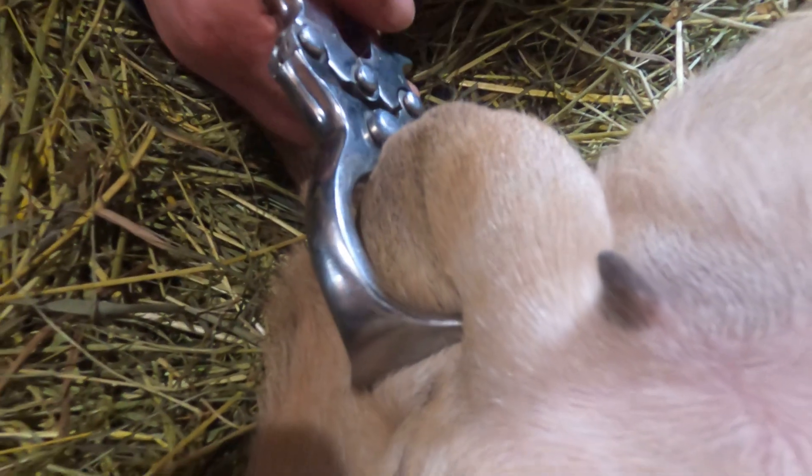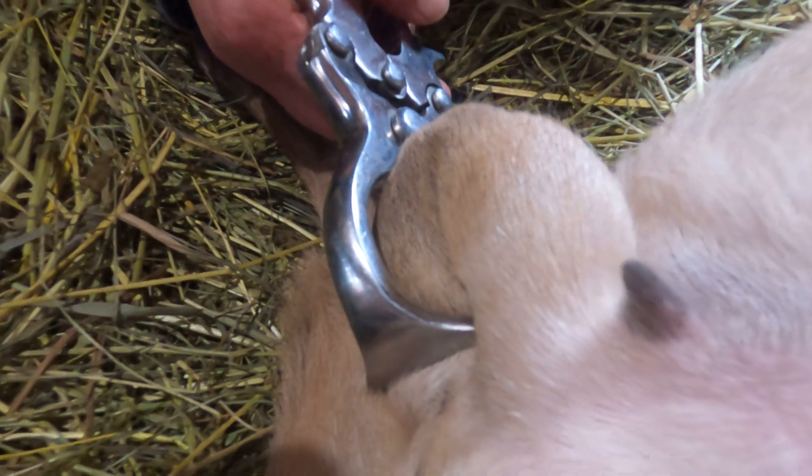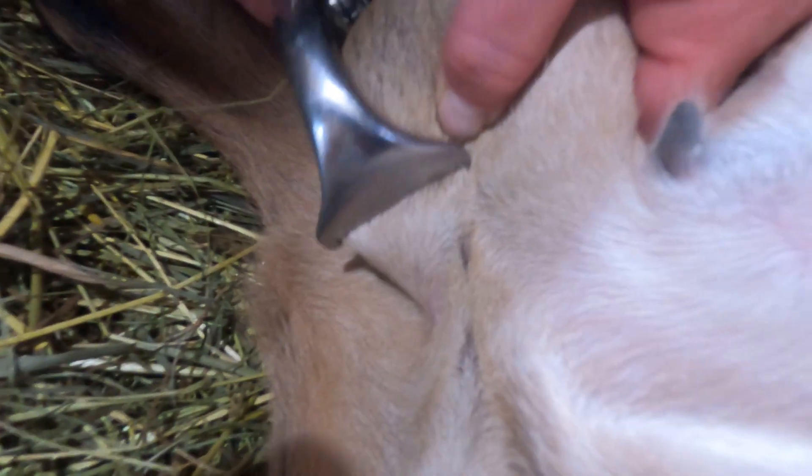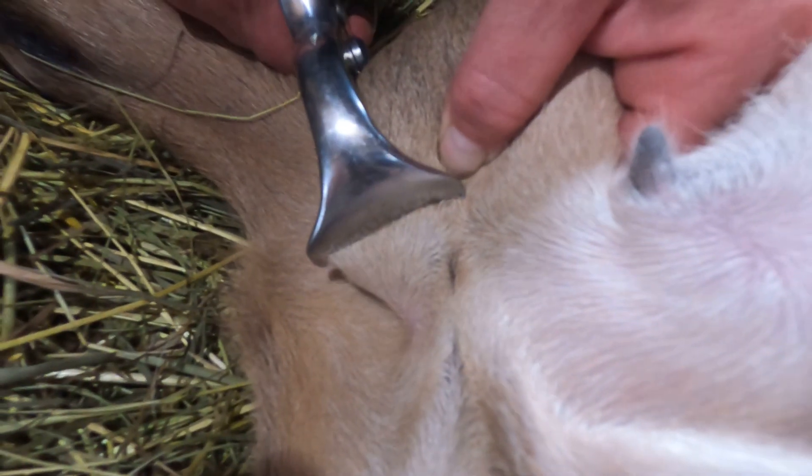Our vet lightly sedates the bucklings. She uses the emasculatome to crush the spermatic cord through unbroken skin. Killing the spermatic cords causes the testicles to atrophy, or to shrivel up over time. The scrotum remains intact, though.